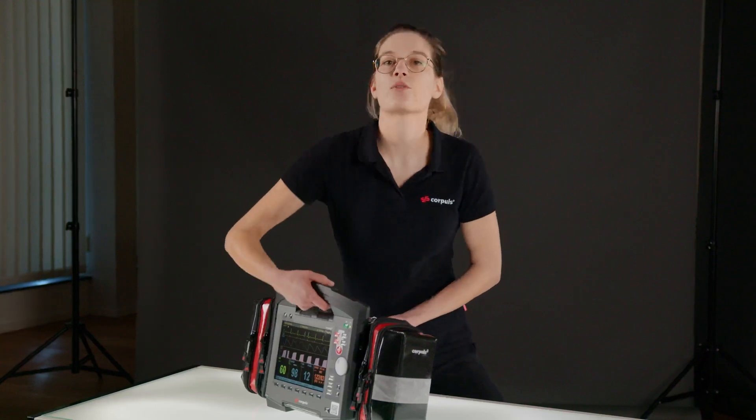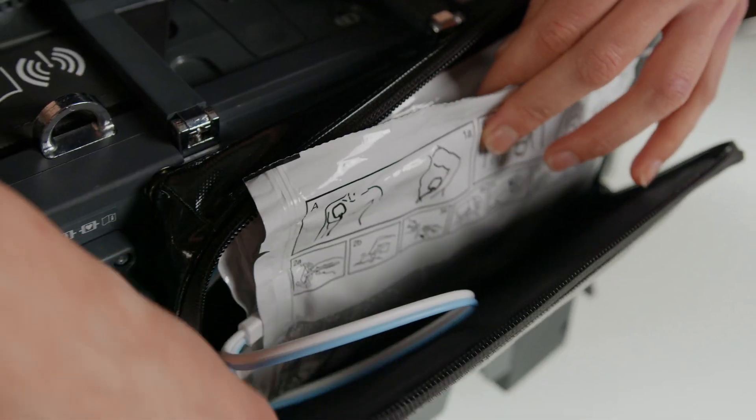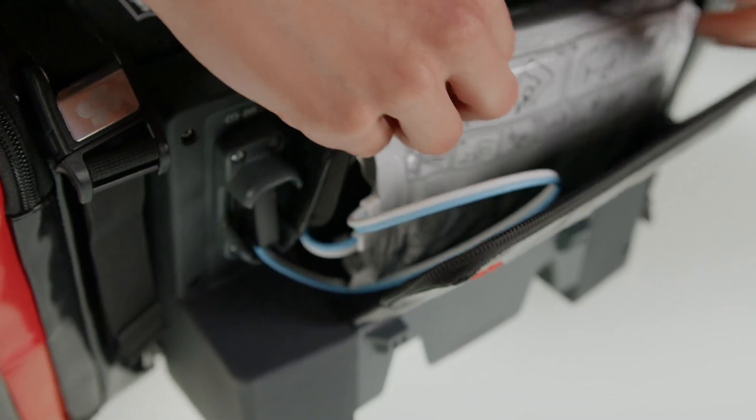There is also a pocket on the back of the device. This contains two sets of defibrillation electrodes. One of them is already pre-connected and the other is a replacement.